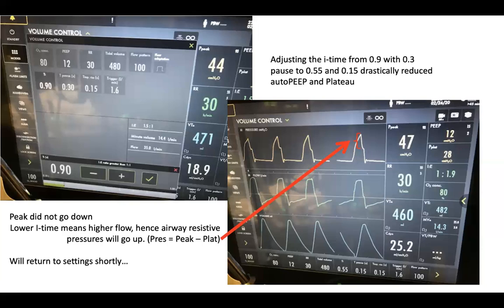is less likely to contribute to frank barotrauma, except in cases of upper airway injury, or upper airway anastomosis after lung resection or transplant. And really we focus on the plateau pressure, and having a lower plateau pressure by a considerable amount due to lower auto-PEEP values is more likely to preserve lung integrity and avoid barotrauma.